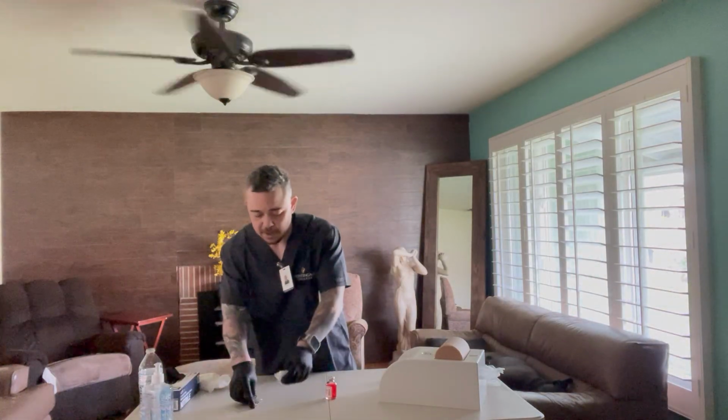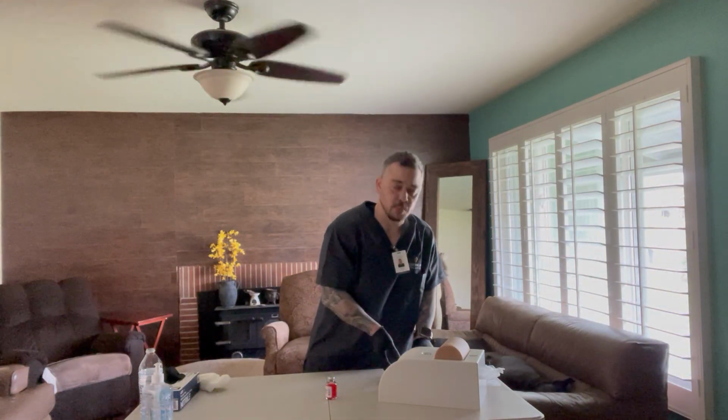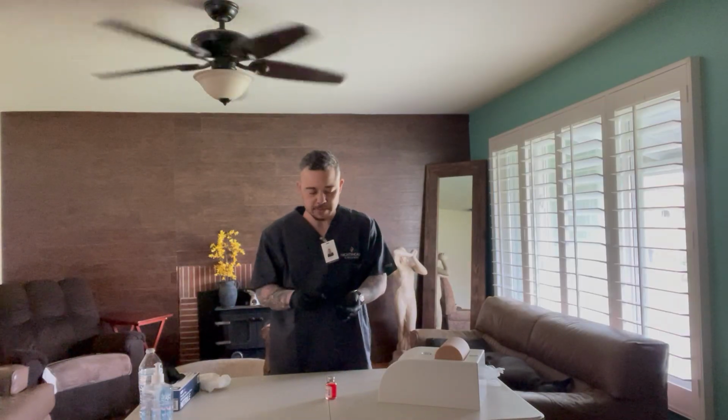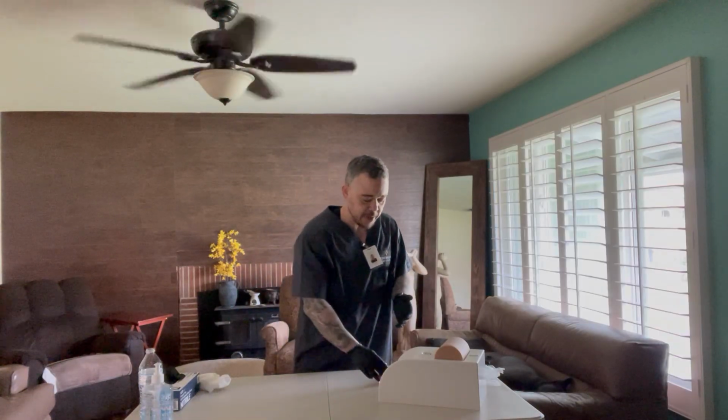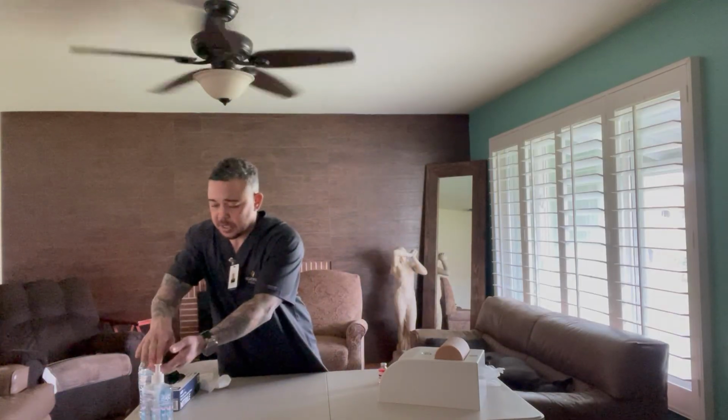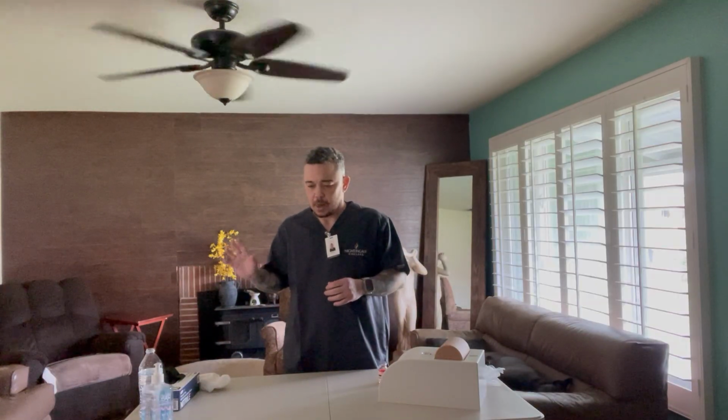The next thing I'm going to do, I want to clean up my site. Make sure I put all my stuff away into the receptacle. I have my needle put into the needle receptacle. Put my medication away. I'm going to take my gloves off. I'm going to use hand hygiene. I'm going to make sure my patient's put back into a comfortable position. Then I'm going to give him the call light, check to see if there are any side effects or adverse effects. The patient is good, and ask if he has any questions.